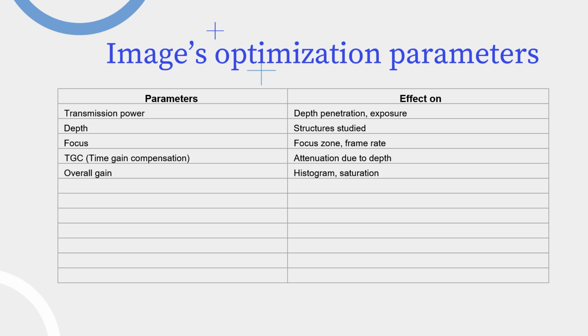The dynamic range refers to the range of echoes from strong to weak available to be displayed on the monitor at a particular time. Increasing dynamic range gives a wider range of grays and decreases contrast.